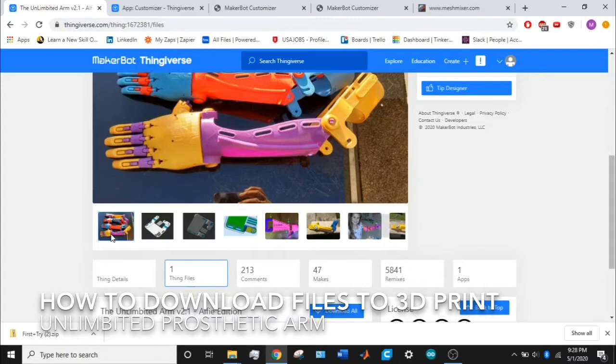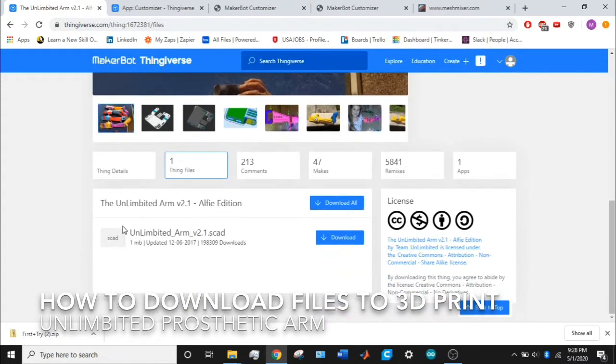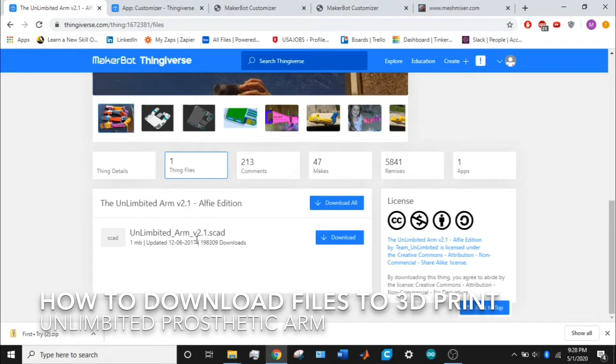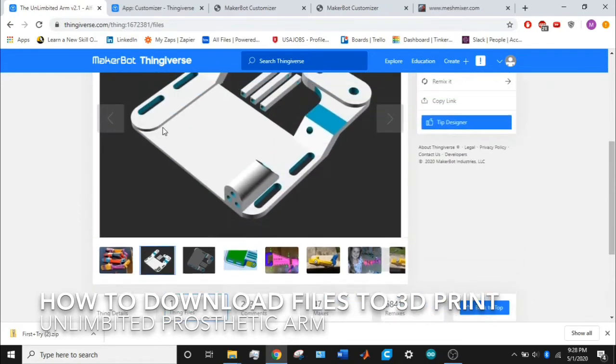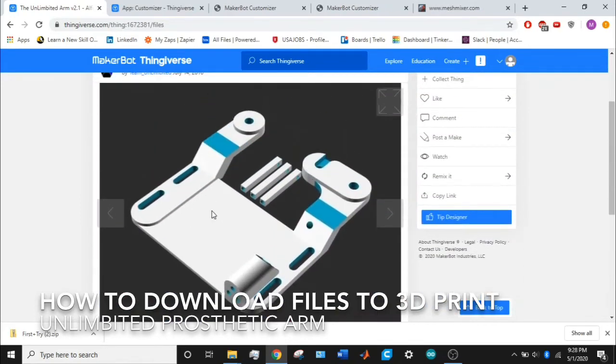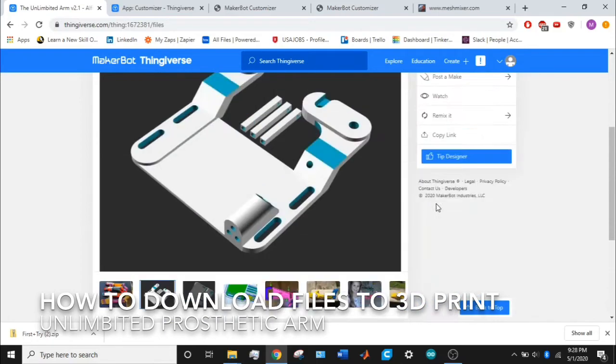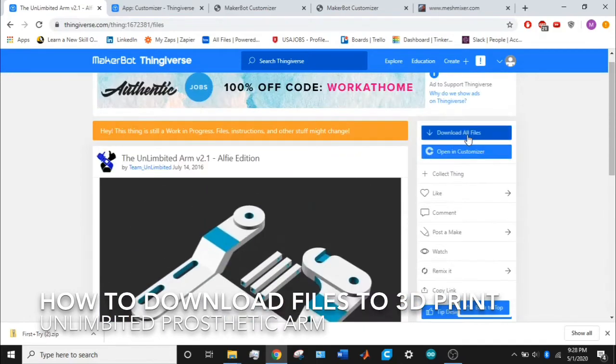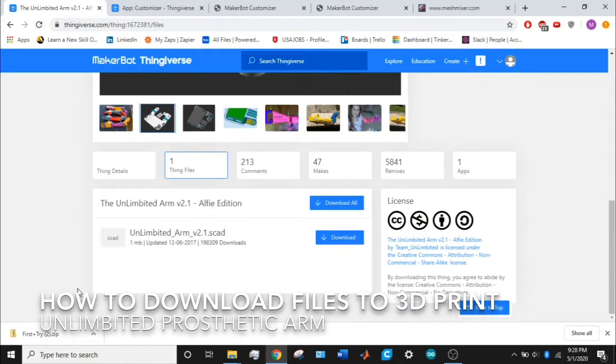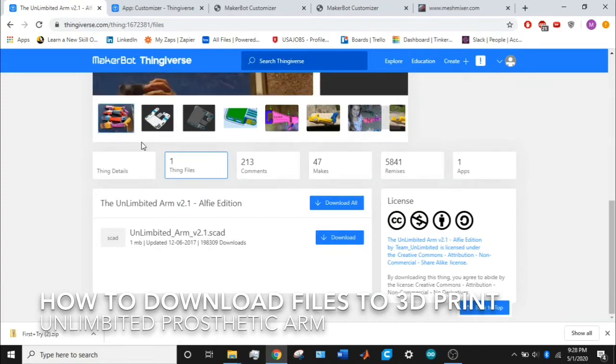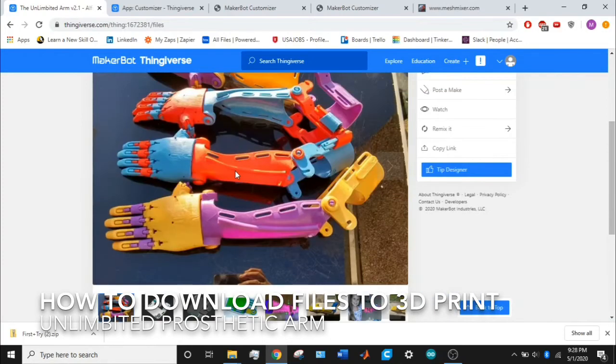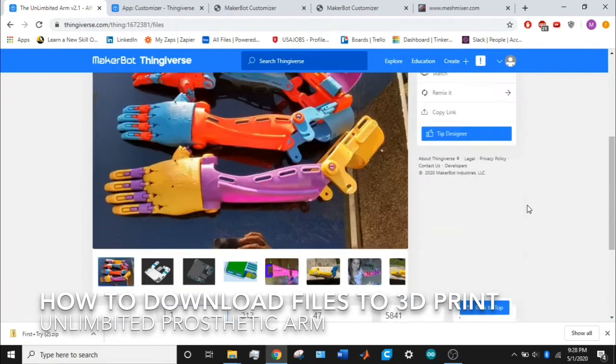For some reason, I think they're just undergoing some maintenance on the designs, but right now there's only one type of file that you're able to download, and that would be the tricep cuff. If you click download all, you'll only download this, and you need more parts than just this one part to build the full prosthetic arm.